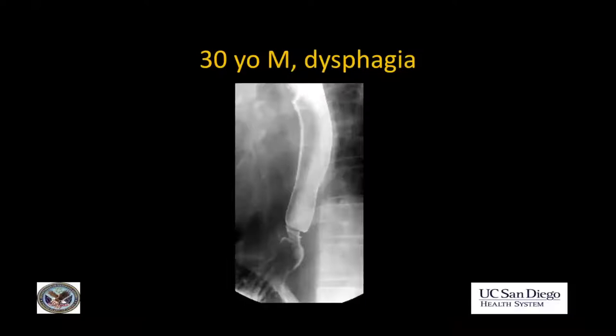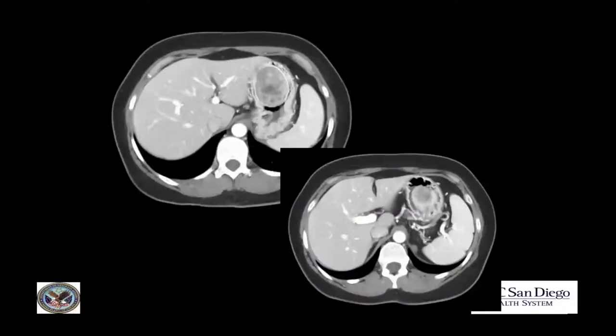Another case is a young male with history of dysphagia who has these ring-like narrowings in the lower esophagus. What do you think of this mass in the stomach? And lastly, what do you think of this grape-like mass in the distal stomach slash first part of the duodenum?